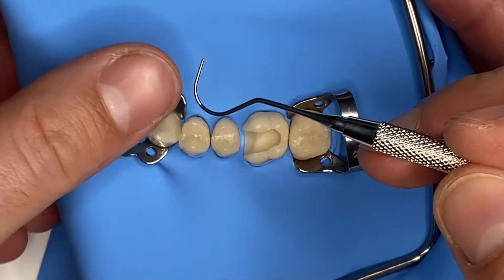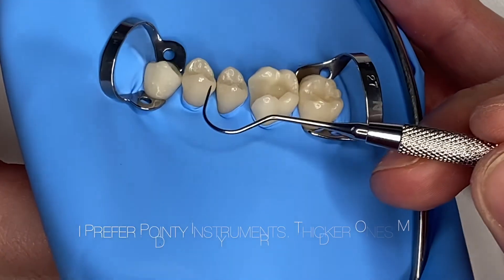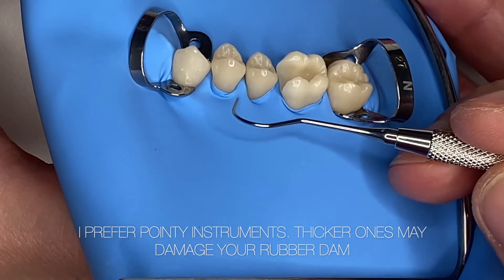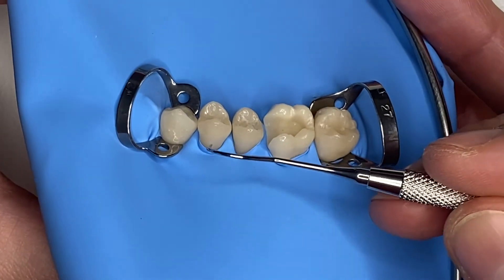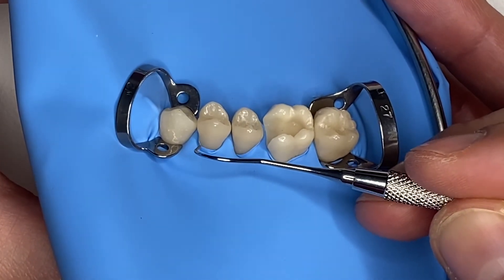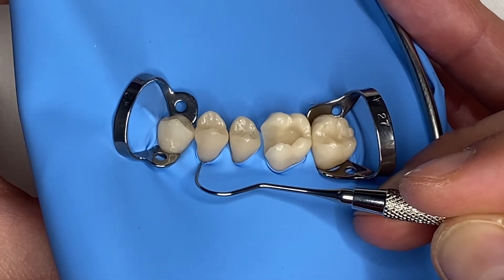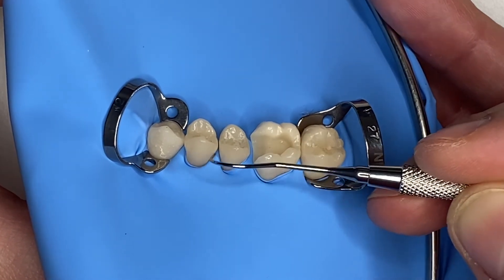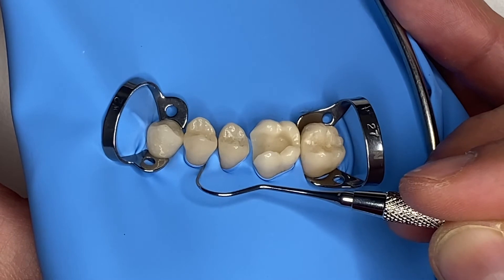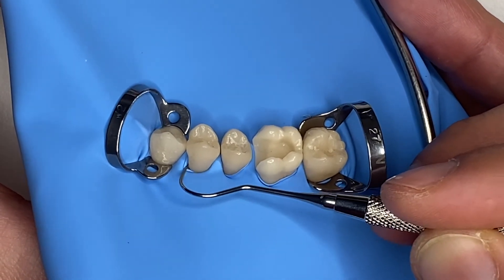I can use a probe, and I've also had a question regarding this — how do I use the probe in order not to cut the rubber dam? Well, I just place it at a 45-degree angle around the crown of the tooth, and then I gently push towards the gingiva and follow the contour of the tooth. I do this once from mesial to distal, and then again from distal to mesial.